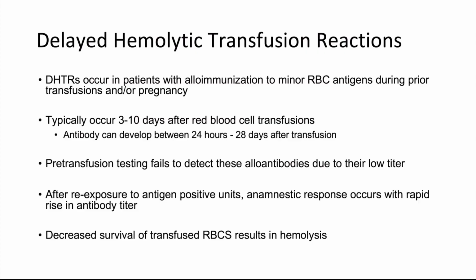The diagnosis here is a delayed hemolytic transfusion reaction. This occurs when a patient is alloimmunized to minor red cell antigens during prior transfusions or pregnancy. We typically see these 3 to 10 days after a red cell transfusion, but this antibody can develop 24 hours to 28 days.